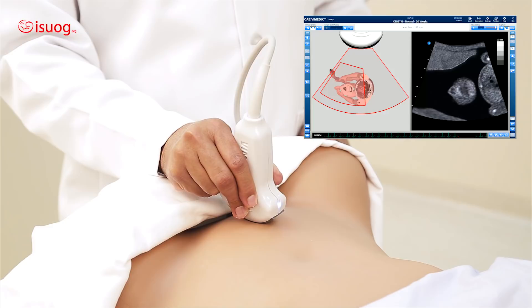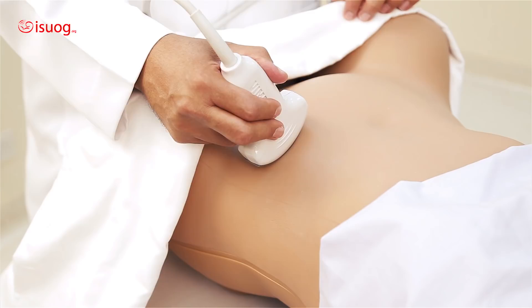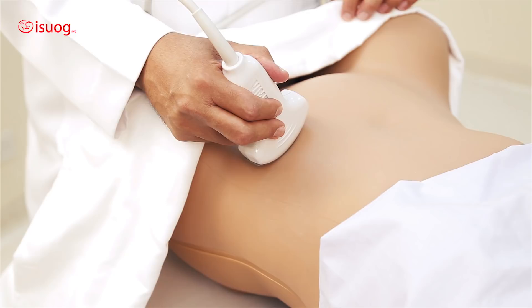Another example of a combined movement is when trying to get a sagittal view of the spine. If you need a sagittal view of any structure, you need to bring a transverse view of that target to 12 o'clock. And that's what we are trying with the spine. This is a transverse view of the abdomen. In order to bring the spine to 12 o'clock, I am going to dip.